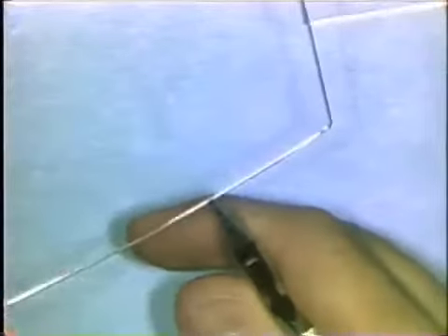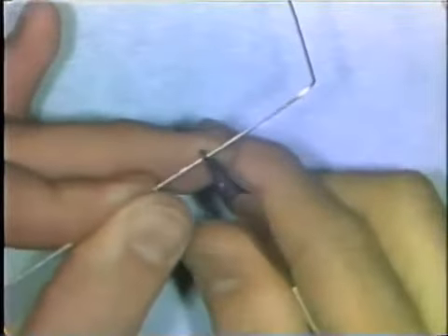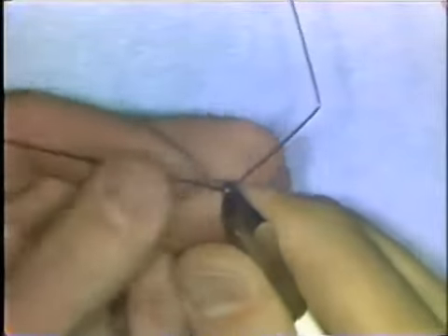Thirdly, don't bend the wire over the round beak or the square beak of the 139 pliers. If you do, it's possible to create a small surface defect in the wire, a nick in the wire that may bring about breakage later on.